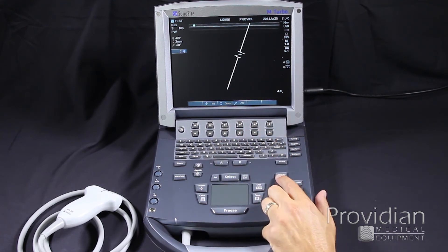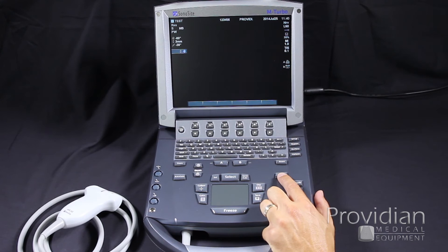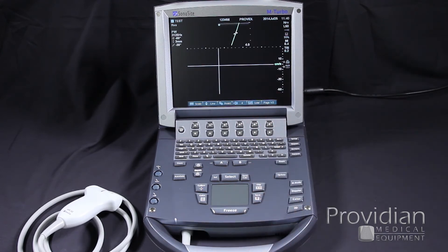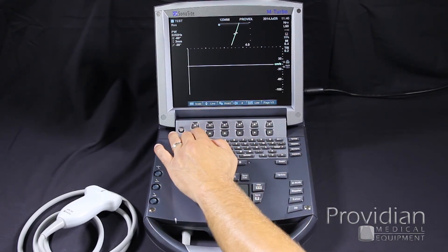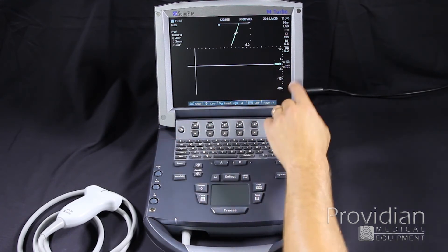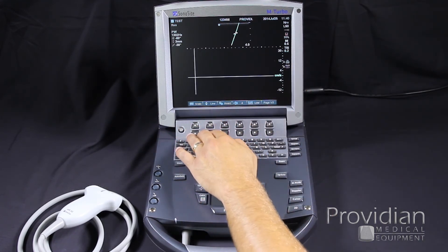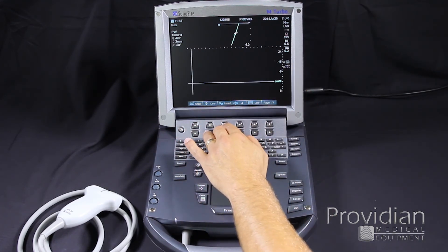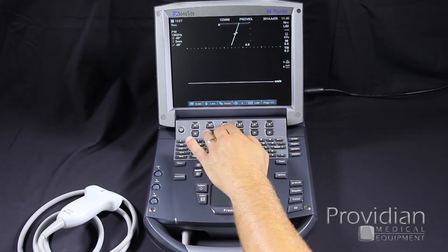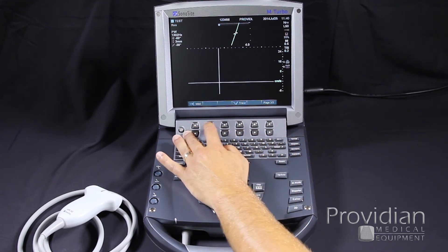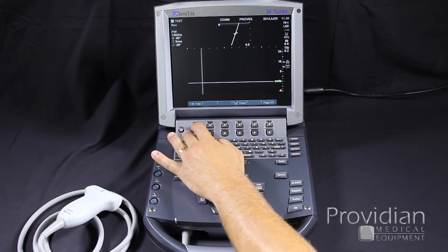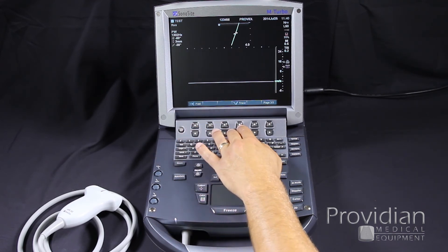To go into spectral Doppler, we'll click the update key. Here we have our spectral Doppler. Like color, we have controls for our scale — change our scale, adjust the baseline, invert the Doppler signal, change our volume, wall filter, sensitivity, and speed. And here we have our trace.